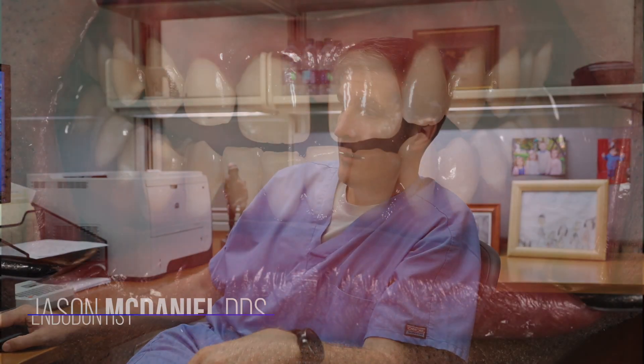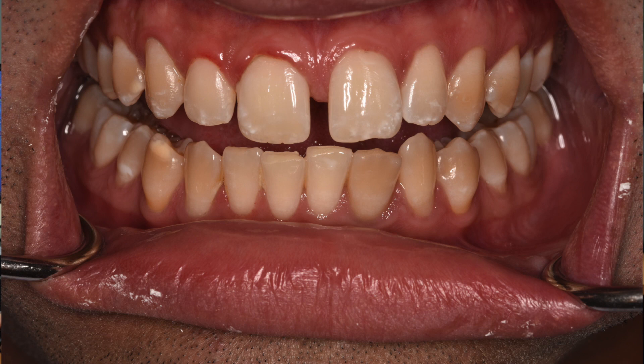We have a 27-year-old patient who presents with lower anterior swelling. When you look at the radiograph you can see that tooth number 23 has the radiographic appearance of dens in dente, and it's been previously treated but it's just not working because all around the tooth, within the tooth, is what amounts to untreated canal space. It's virtually impossible to clean out through conventional endodontics.